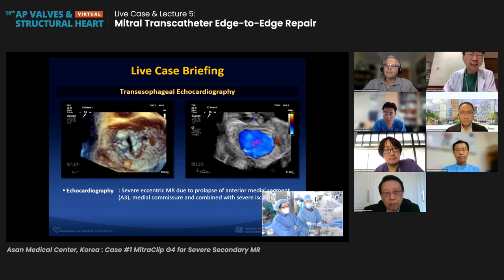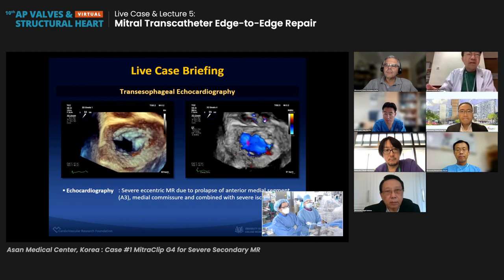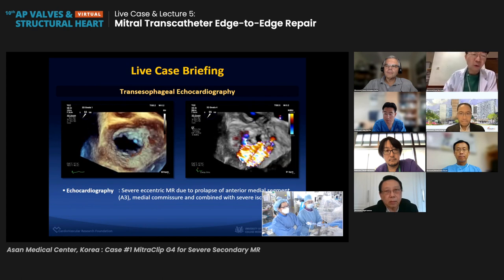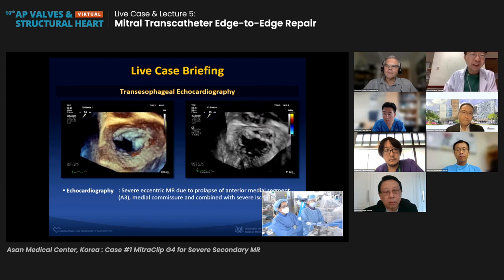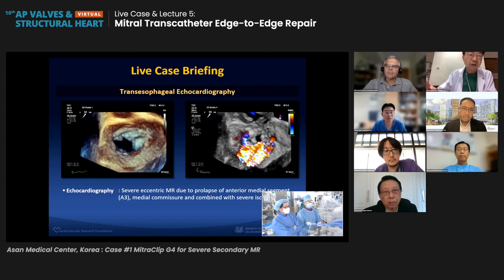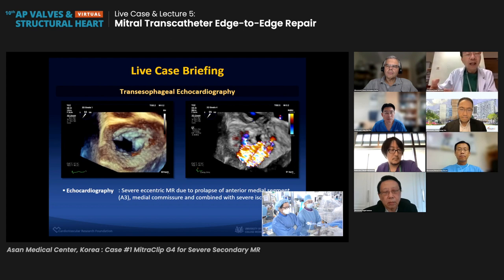This patient has a long-standing history of ischemic cardiomyopathy. What I think accounts for the sudden progressive deterioration recently must be the rupture of the chordae of the A3. So I agree that we need to treat that chordal rupture first. Of course, surgery is the best option in view of the relatively young age and the STS score of around 4% for mitral valve repair. But unfortunately, the patient refused surgery. So a percutaneous approach with mitral clip is a reasonable option to tackle the primary MR due to the chordal rupture first, and then see how it progresses.